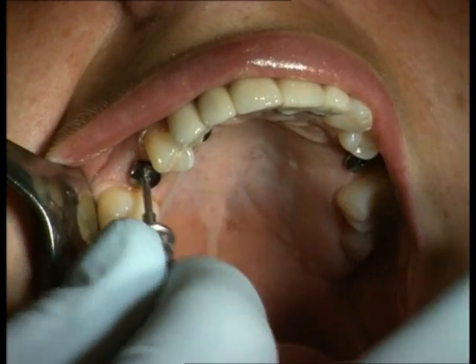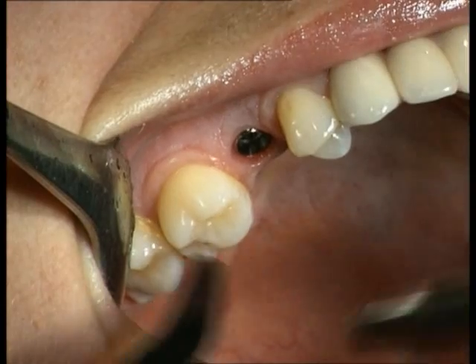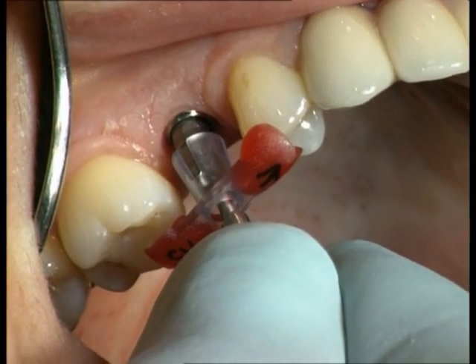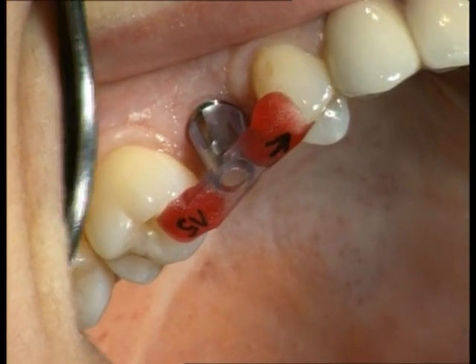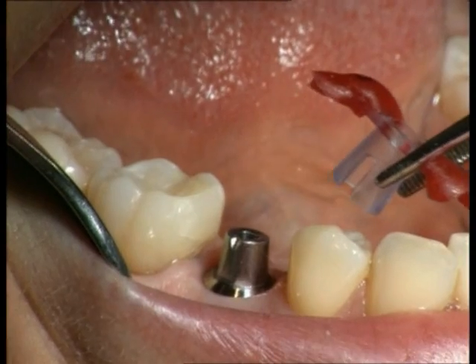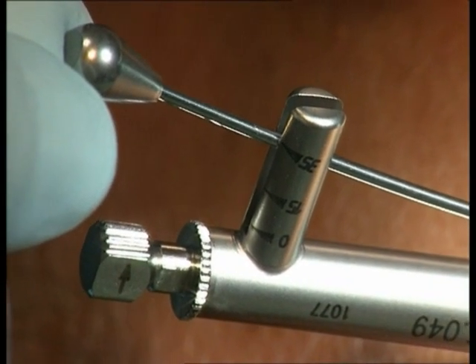In the dental office, the healing caps are removed, and the interiors of the implants are thoroughly cleaned and dried. Then the Synocta cemented abutments are placed inside the internal octagons of the implants using the transfer index that was created. Using the SCS screwdriver and the ratchet with torque control device, the base screws are tightened in the abutments. The torque should be 35 Newton centimeters.